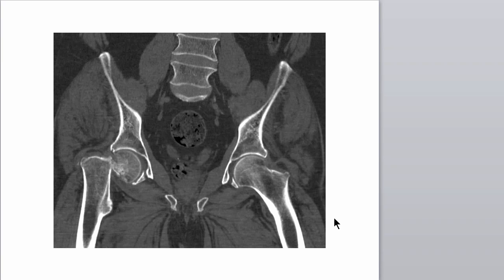Now what in the heck is this? This is a CT scan — remember, it cuts in slices. This is a coronal CT scan. Do you see anything strange? We're just looking at the femur. This is a normal femur here — there's a trochanter, and here's the cortex, this really white region, which is very thick. Now let's look at the other side. Whoa — that's right, we have a fracture and displacement of the femoral neck on this side. So displaced fracture — not a good thing.